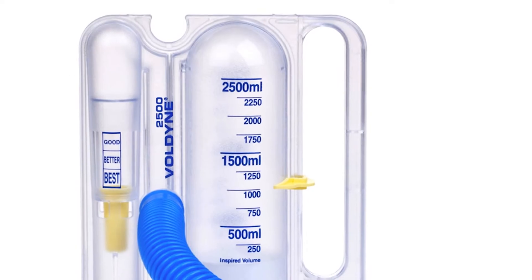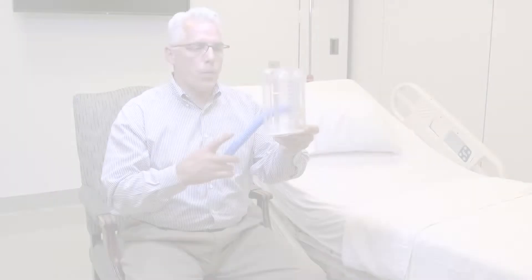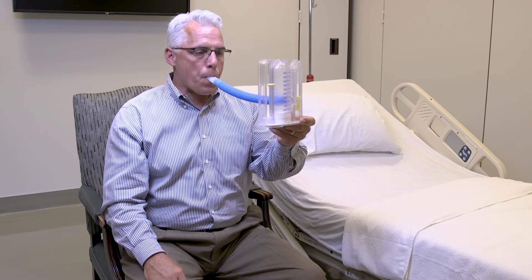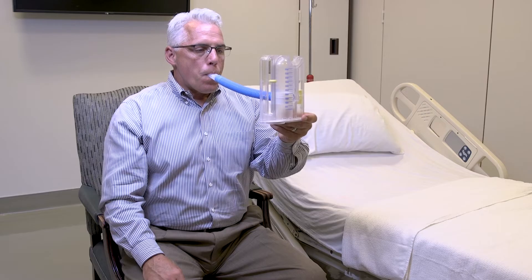An incentive spirometer, commonly called an IS, is a breathing tool that helps you keep your lungs open and clear after surgery. Before your procedure, you'll need to practice using your IS at home. While in the hospital, you'll be asked to take 10 deep breaths through your IS every hour while you're awake. After you're discharged, you'll continue to use your IS for a specified period of time.